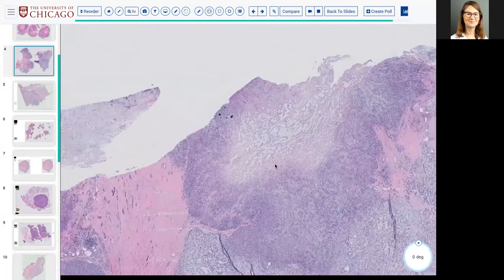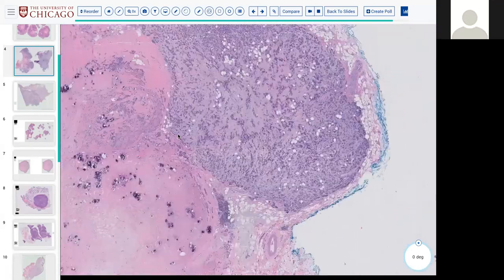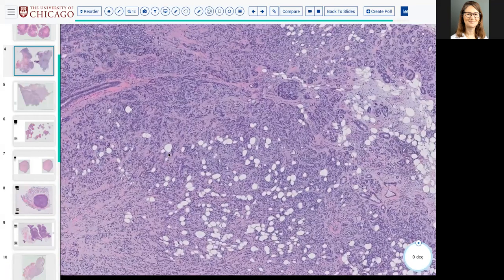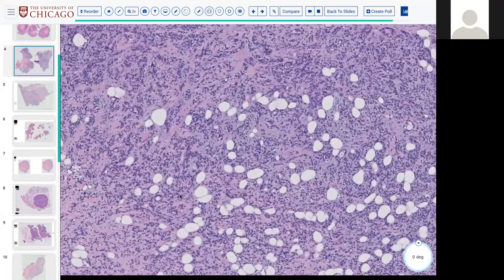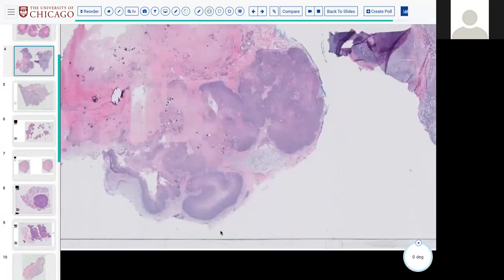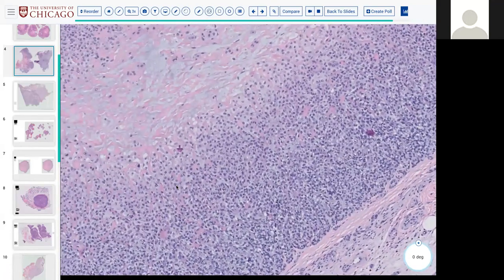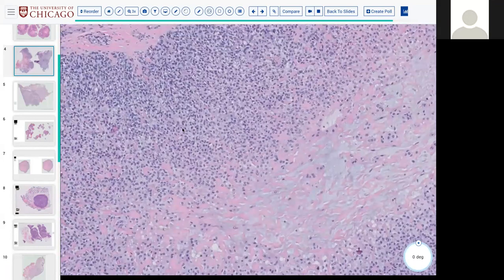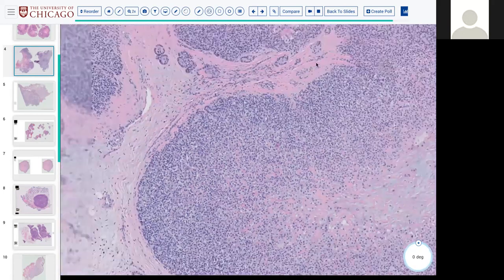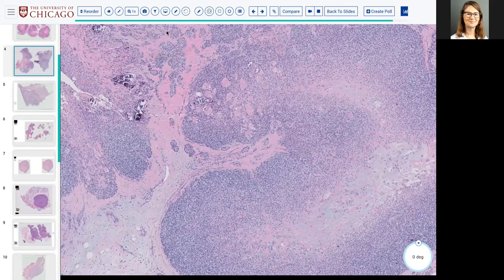For EMC, wouldn't you want to see nice stacking, ideally at least? Tell us what you mean by stacking. With the big puffy cleared-out myoeps on the outside that envelop the little epithelials on the inside. I know that you can get overgrowth of the myoeps on the outside, so all you're seeing are these clearer cells. But I guess, ideally anyway, you'd want to see a two-tiered configuration. Yeah, I agree with you.